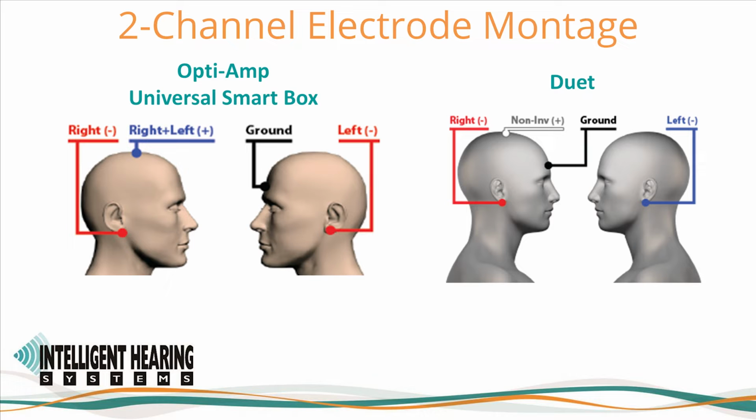If you will be monitoring the eye blink artifact, then you would connect the recording electrodes to the appropriate channel and then use the second opposite channel to monitor the eye blink by placing the positive and negative electrodes above and below the eye, respectively.